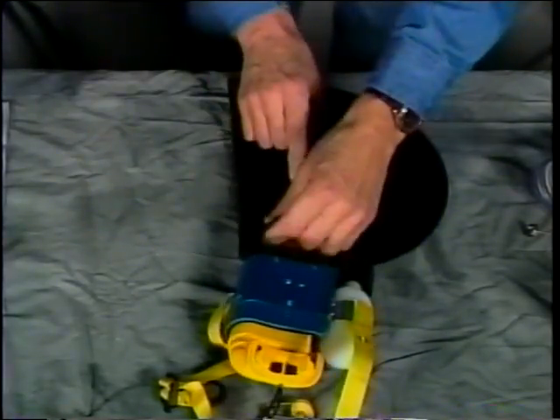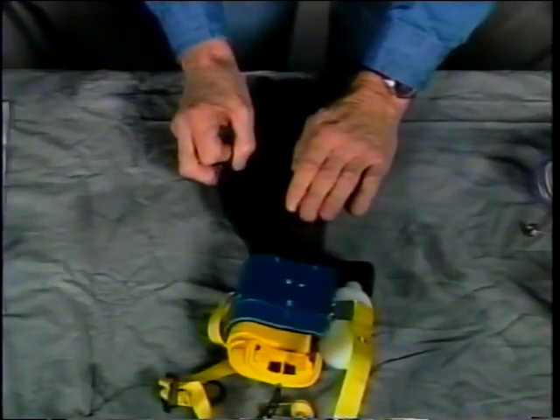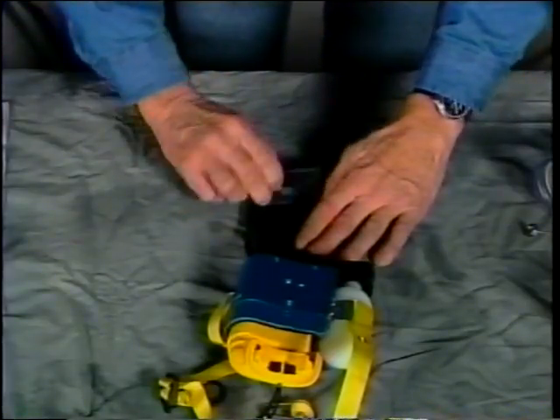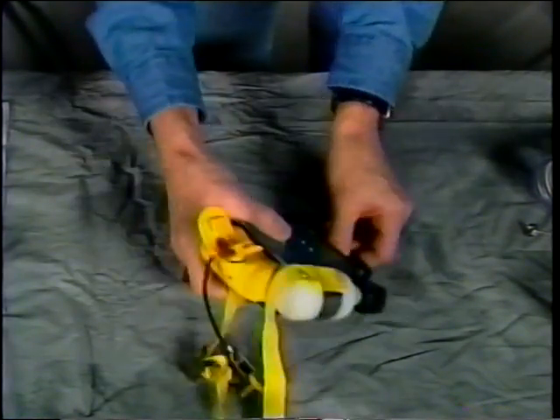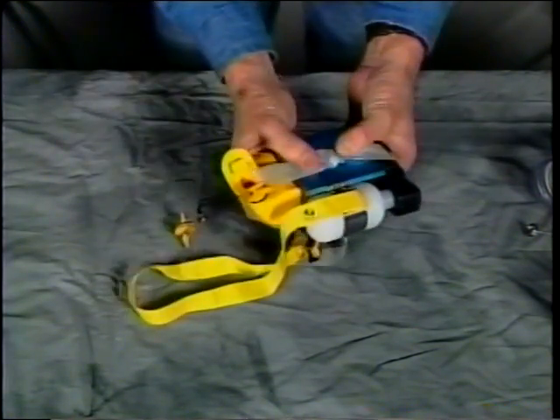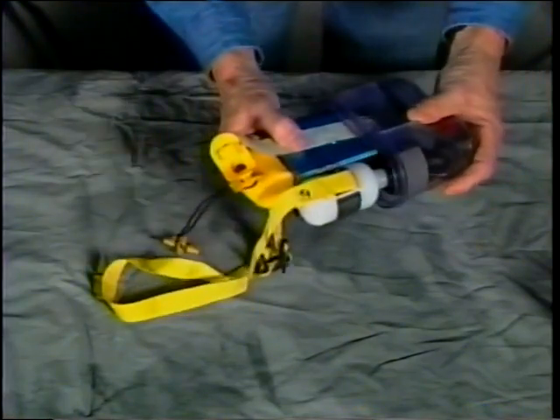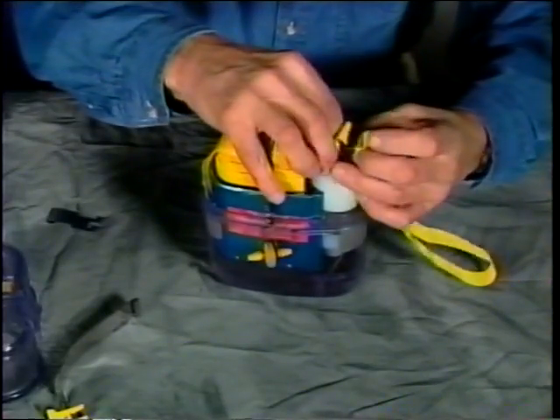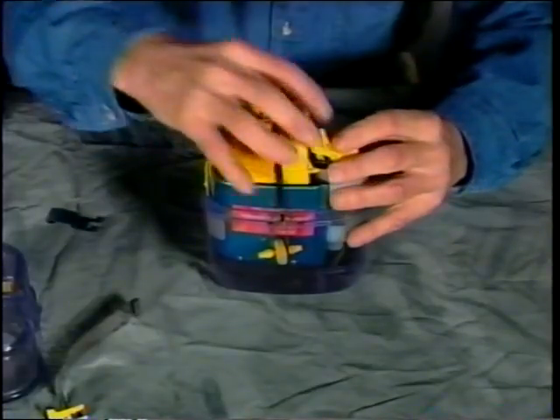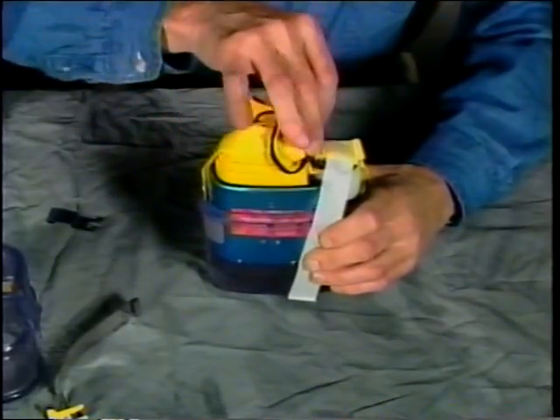Fold the black breathing bag as shown. Reconnect the activation cable snap located in the clear base. Place the training unit in the base. Fold the neck strap as shown. Put on the cover and latch assembly.